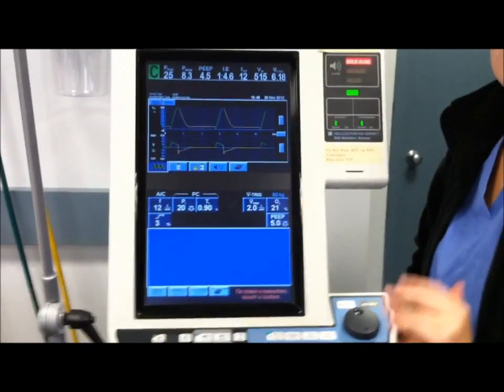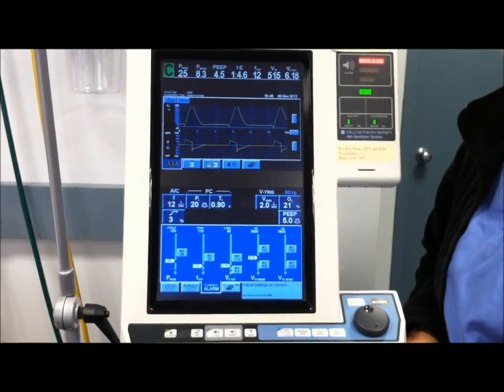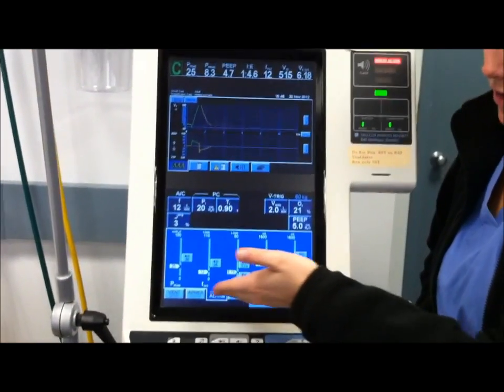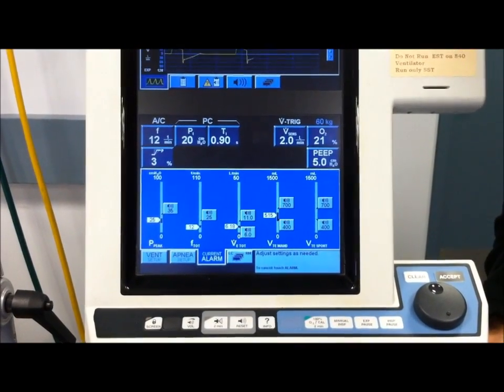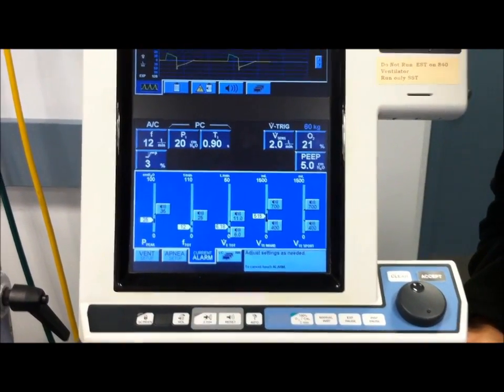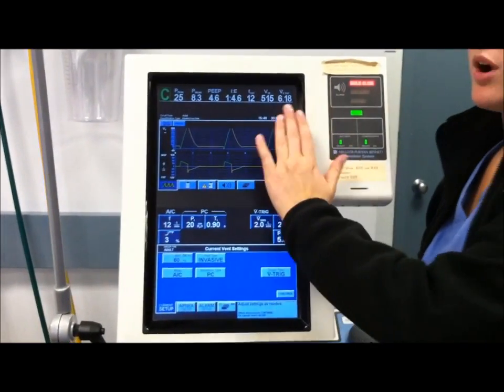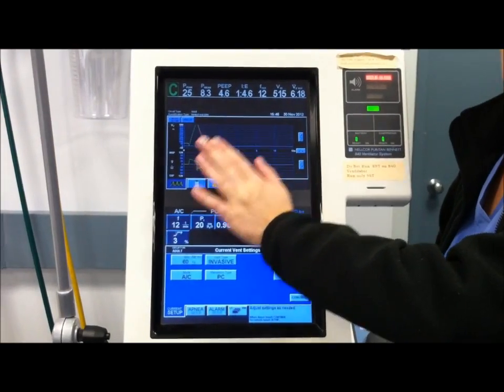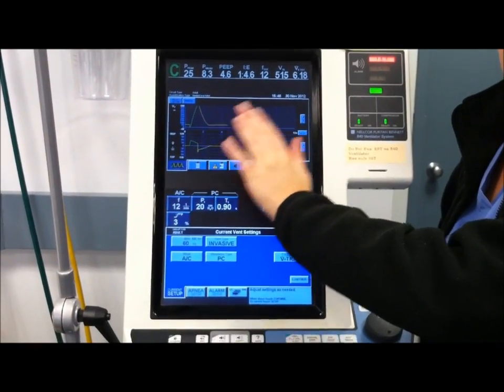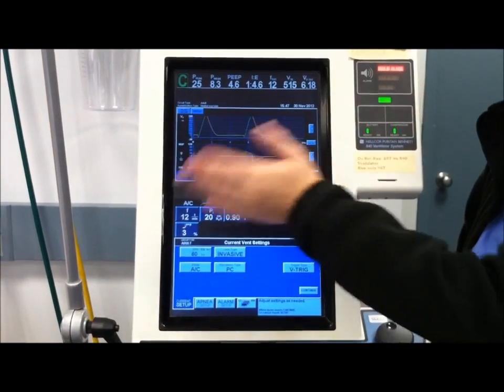And then make sure when you set your settings on your ventilator, you set your alarms appropriately. And in here we have our alarms set appropriately for this patient. And also, when treating a patient, a big part is looking at their waveforms, especially if they developed auto-PEEP, if they have increased airway resistance, or if they were in another mode, if they were assisting.